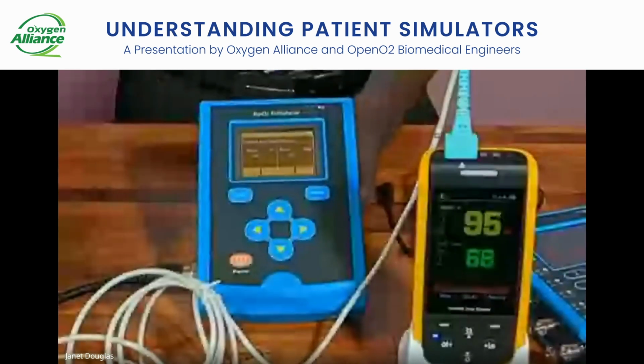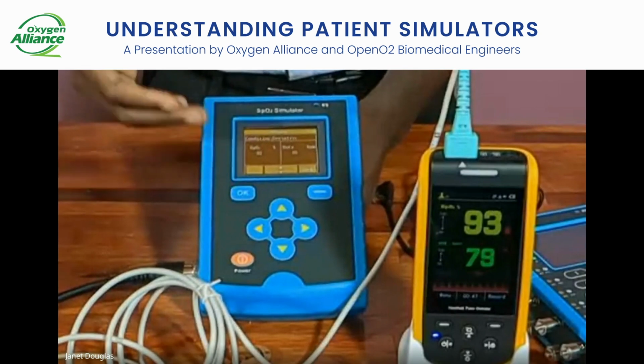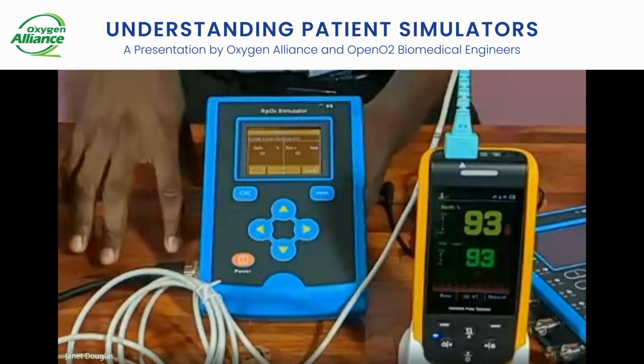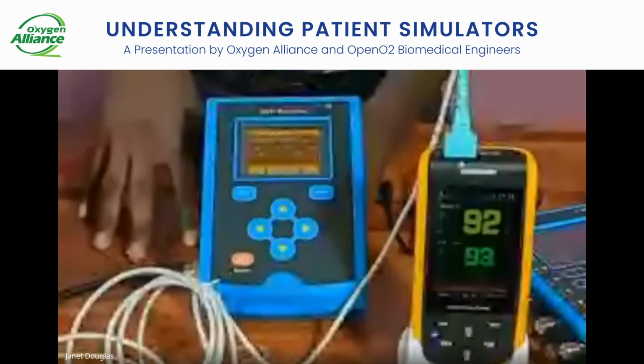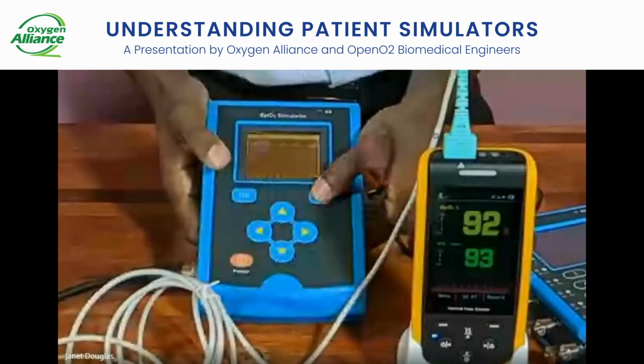So it has preset conditions: if the patient is obese, usually the SpO2 is going to be around these ranges, and then it will simulate that. So you need to make sure that you are testing the monitoring device across various scenarios. So this has multiple scenarios, multiple conditions.